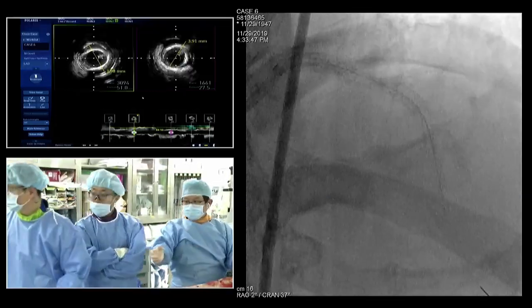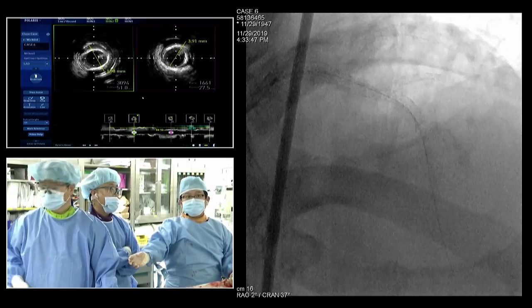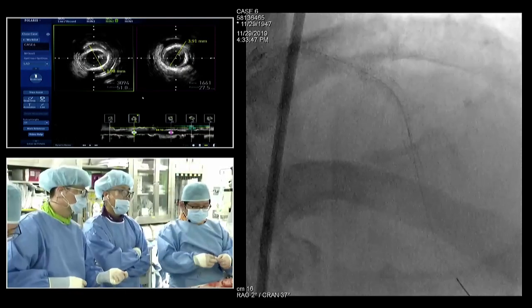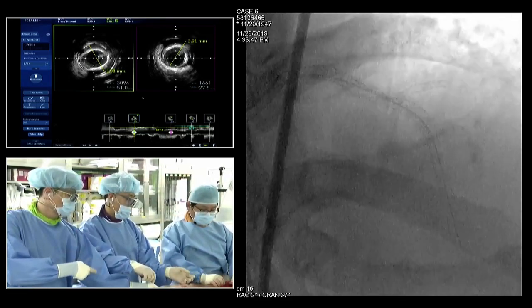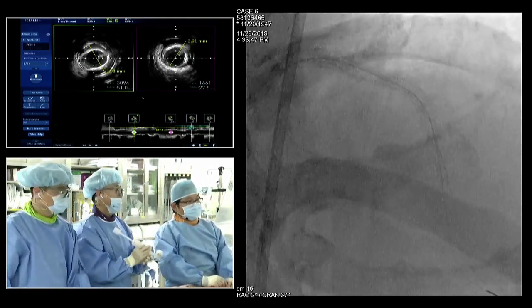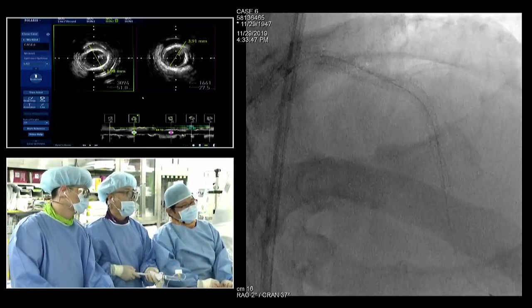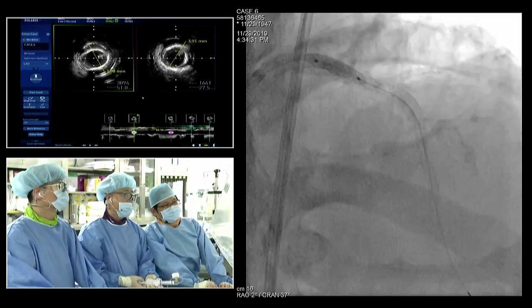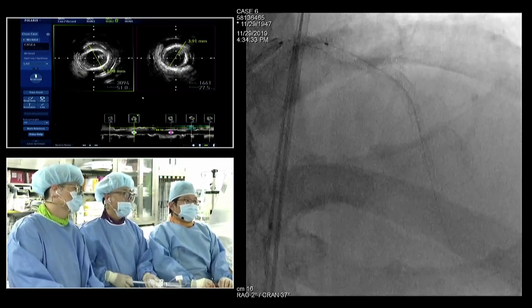Okay, just the remaining part. We'll do the final high pressure for the proximal and distal parts, the proximal LAD also, using a 3.5 high pressure balloon. The mid part of the bifurcation already had the kissing balloon dilation. Dr. Antonio Colombo, I'm really sorry I cannot save the first, second branch. It's okay. You have to consider the septal branches. 10, 12, 14, 14, 16. Okay, deflation. 18.